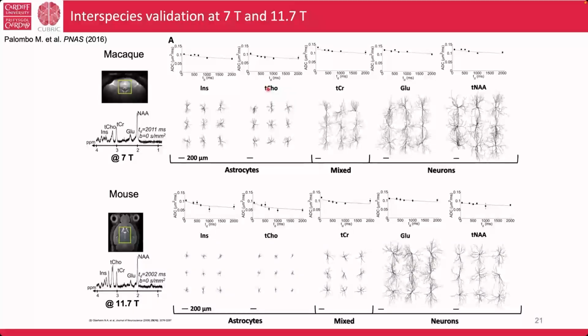And so this can give us also cell-type-specific information. And the second thing is that these molecules are purely intracellular. So we don't need to simulate the whole tissue. We just need to simulate individual cells, and then the total signal is the volume-weighted sum of the signal from each individual cell. If we would use water, we would need a model for the whole tissue because water is inside and outside the cells and perhaps can also cross the membrane.